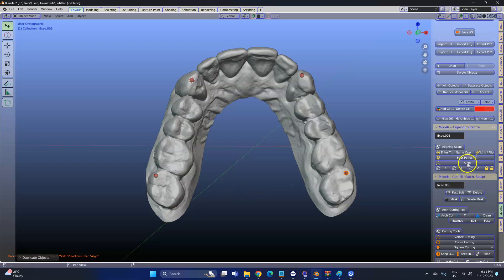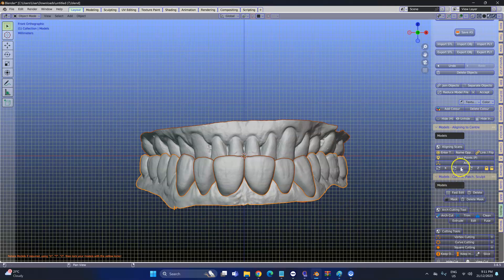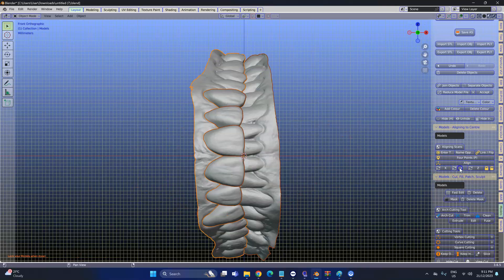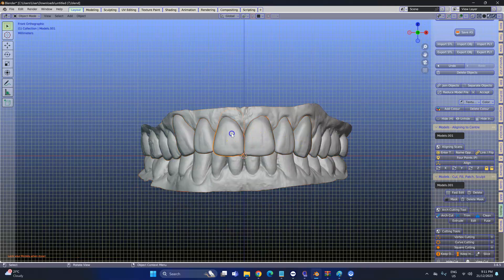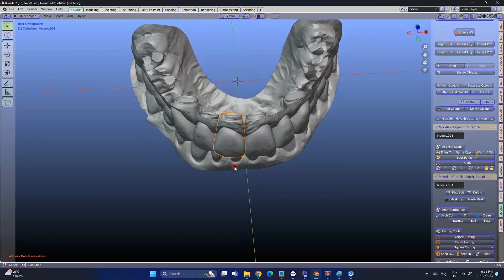Then we're going to click on Align and this will align all of them. Unfortunately it's upside down, so we're going to rotate it. This is the Y axis — rotate it once, twice. Now you're going to see them all separate.